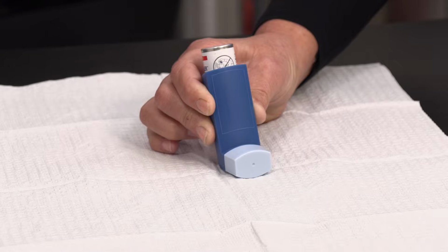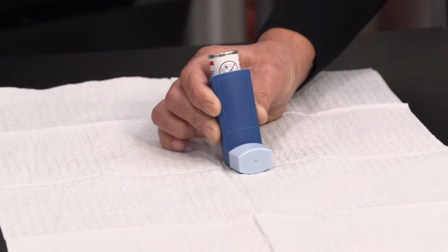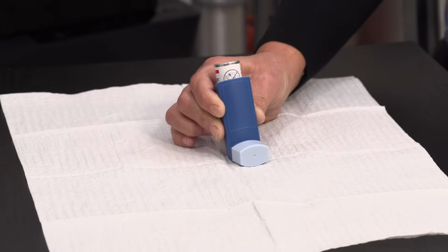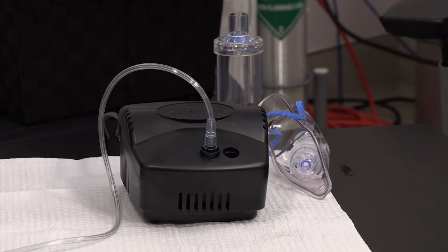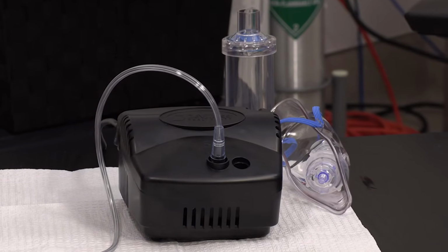In this video, we will discuss how to use a nebulizer machine for your asthma symptoms. Some patients find that if they have difficulty coordinating classic metered dose or dry powder inhalers, then nebulized medications work better for them.